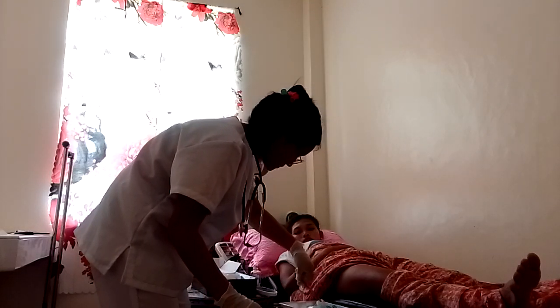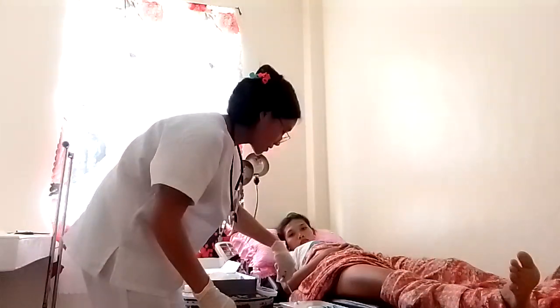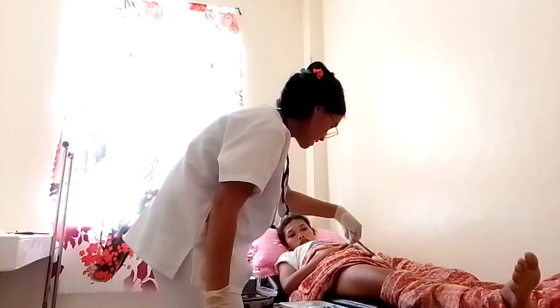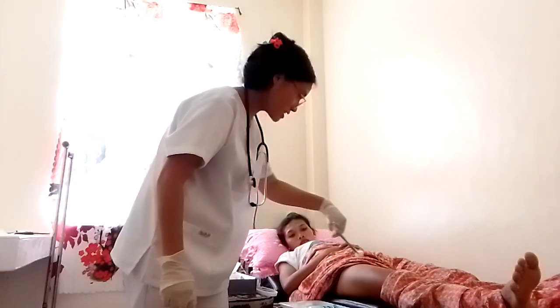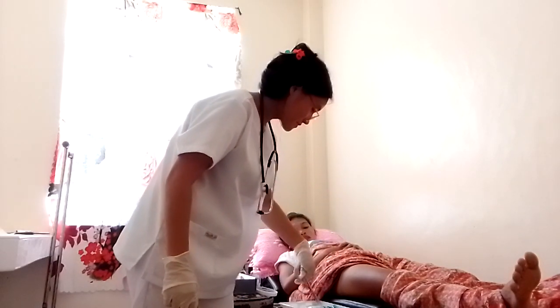Okay na ka, ma'am? Okay. Then kailangan siya butangan og solution ha, di dapat malimot. So one stroke at a time. So, diri sa pikas, butang lang diretso ang ginamit diri sa atong waste receptacle. Then, get one. Okay na ka, ma'am? Okay na, ma'am.